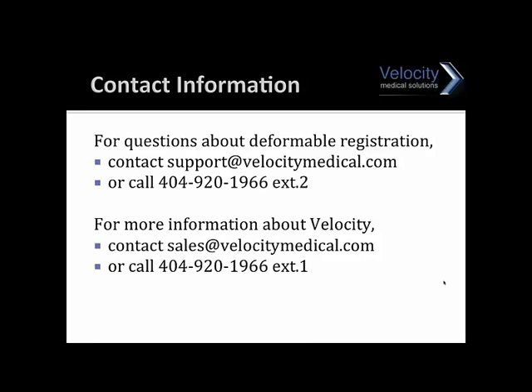I think there are some questions coming in about the QA options. First question is, are they new to Velocity? There are some that are new in this version. The warp map we've had in all of our previous versions, I believe.